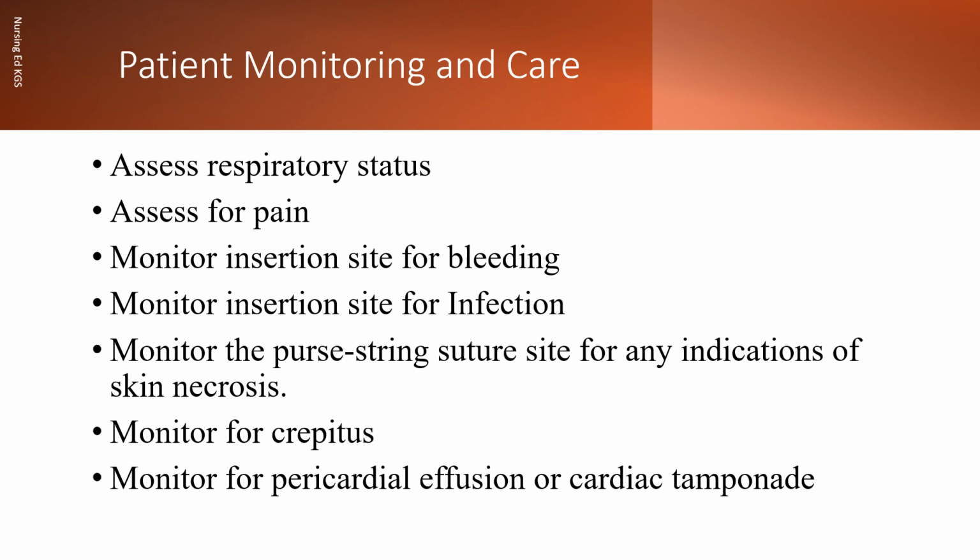For patients who have chest tubes, you'll monitor their respiratory status, assess their pain, monitor the insertion site for bleeding and infection, and you'll also monitor the insertion site for development of subcutaneous emphysema or crepitus.